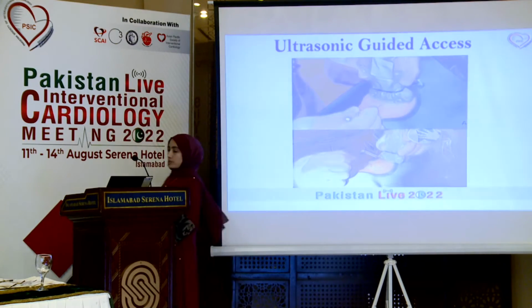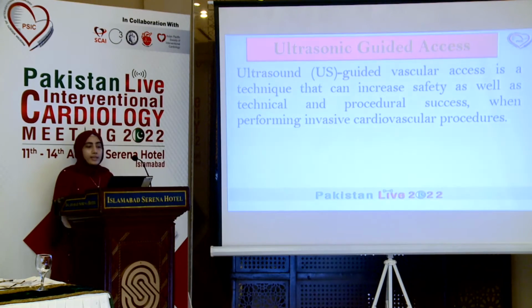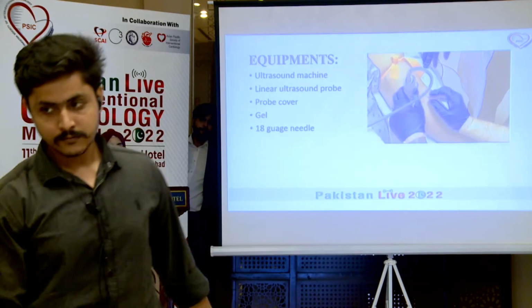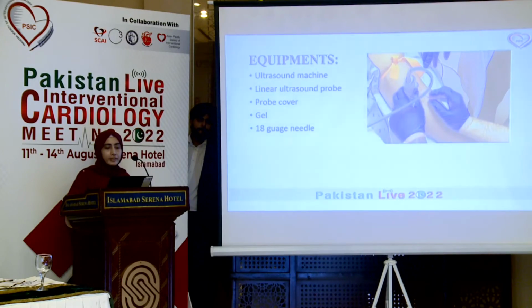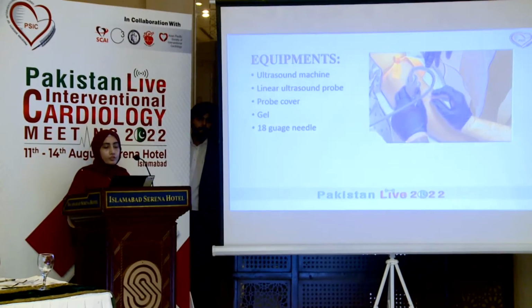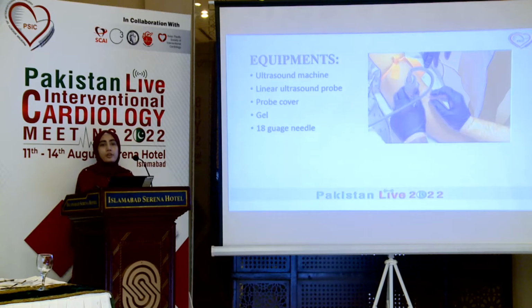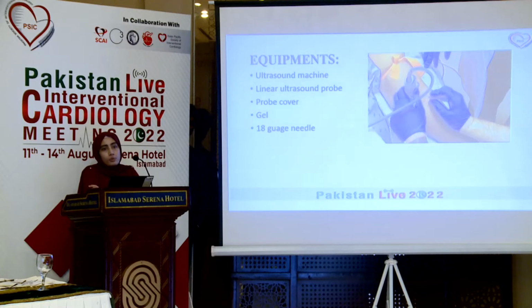Ultrasonic guided access, which we are using, is a technique that can increase safety as well as technical and procedural success when performing invasive cardiovascular procedures. Equipment includes an ultrasound machine, linear ultrasound probe, gel and 18-gauge needle. Mostly we perform ultrasonic access when the patient is obese, there is a vascular problem, or there is thrombosis or any other underlying cause, then you use the ultrasound machine.